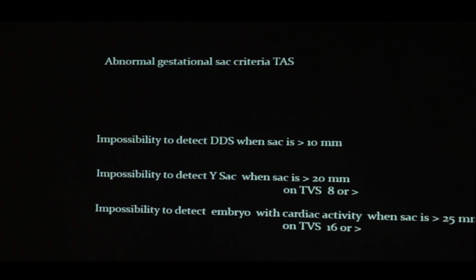That is why I am not giving much time here. When the growth rate fails, that is also abnormal, which we will discuss in detail. So take care. This was the first session of early pregnancy. We will continue with early pregnancy in the next session.